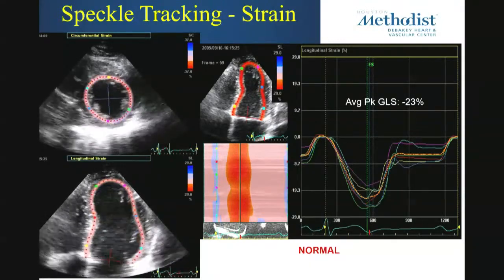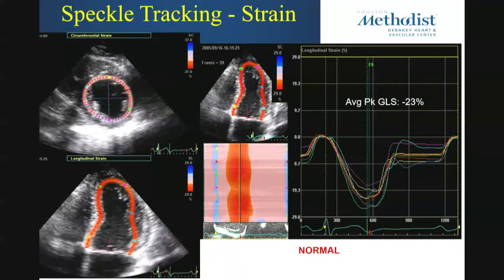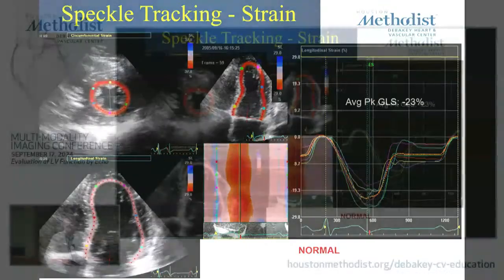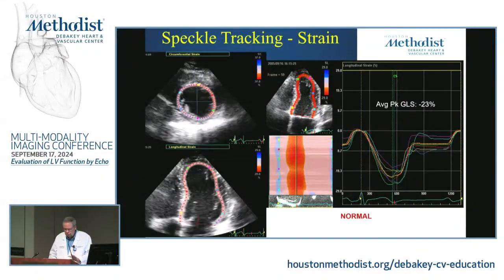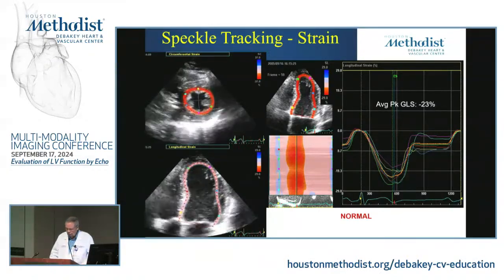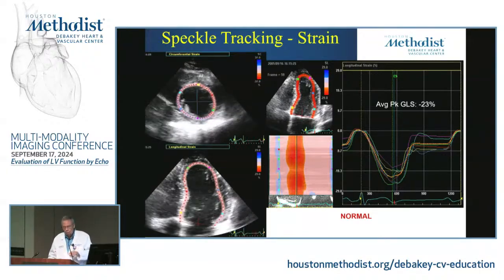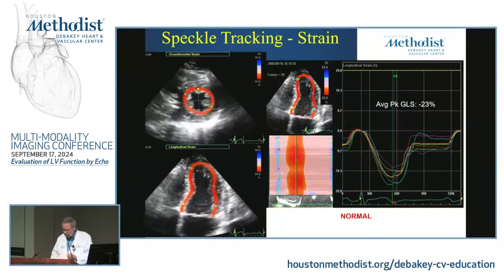And of course, it's going to be even more tricky because now you incorporate a lot more need for time to process and need for very good imaging so that you get a good assessment. So up to now, two-dimensional GLS is still kind of the standard that we're working with. But I want you to know that there is, in fact, a 3D, because those vectors can be going in directions that are even away from the screen.